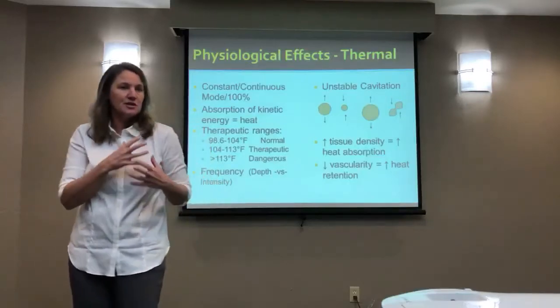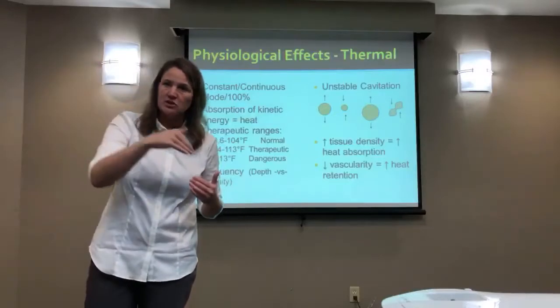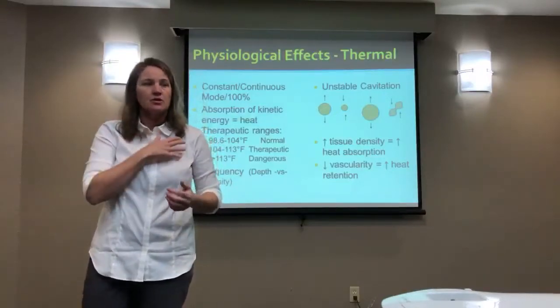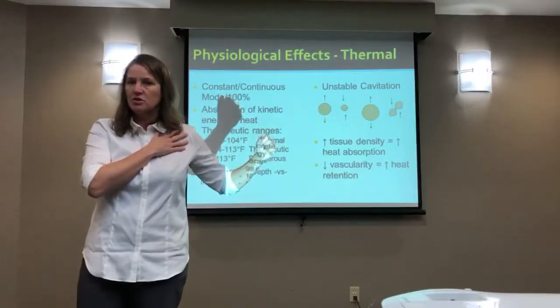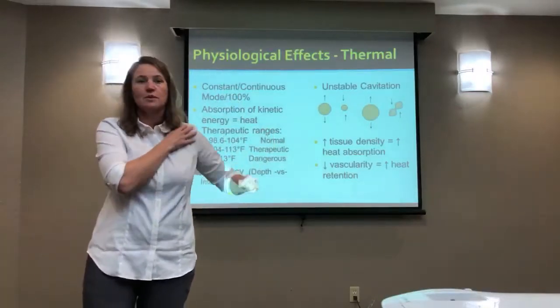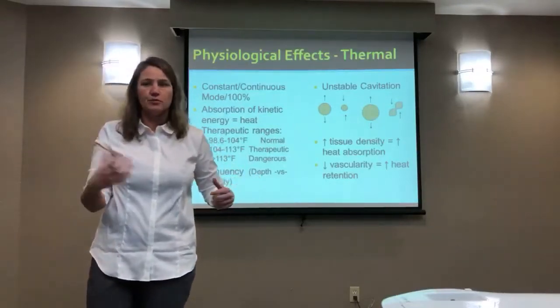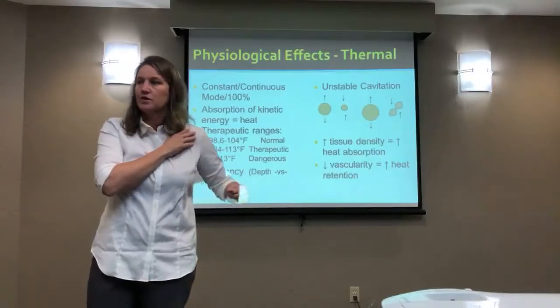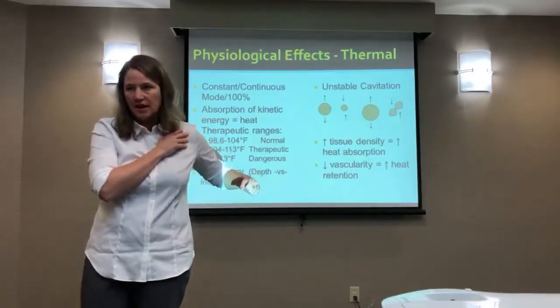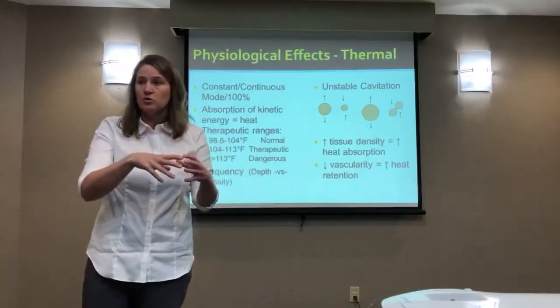In that first minute or so of time, you're already losing your heat. So what I would recommend is that same idea: either put the person in a position of stretch, or have them in a way that you're stretching them. That would be ideal, that you could be providing a stretch that you can feel through your palpation skills, whether you're close to the end range, going into the end range, give it a break, go into the end range, utilize the modality while you do your stretch.